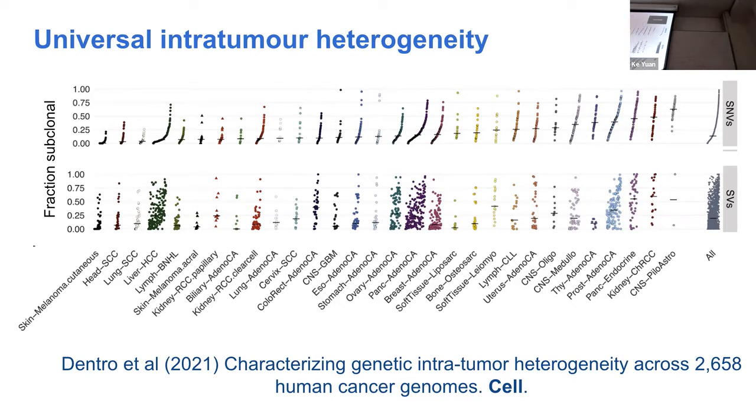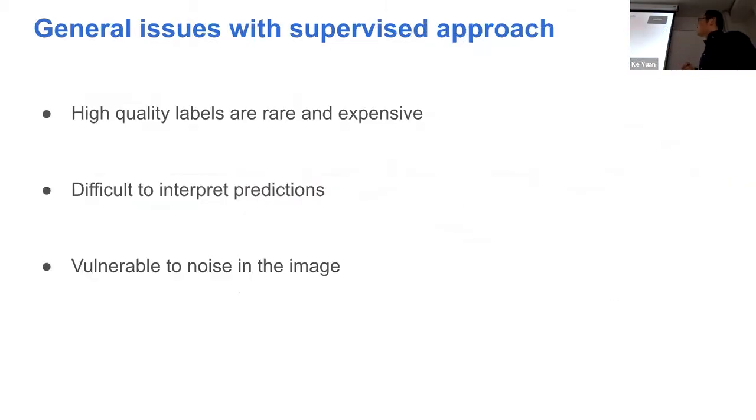So what it means for us, as we're trying to predict mutation from images, is that in the worst case scenario, when you know that this patient with the image has a mutation being positive, label 1, it could be that none of the cells in that image carry that mutation, because that mutation may be detected as a subclonal mutation, only existing in a subpopulation of the cancer cells that happen to not be in the image that you saw. So this generates a huge problem for us.